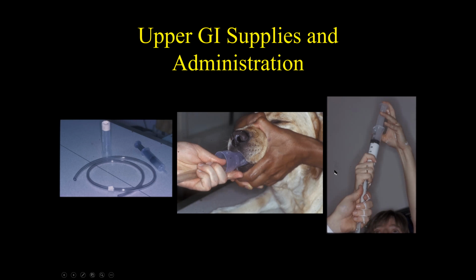So just ensure that, yes, the tip of the tube, I can see it in the stomach. Once you verify it's in the stomach, then you start loading your barium up. And so you would pre-fill, if this dog's 60 pounds, these hold like 60 cc's of barium. And so you're going to pre-fill maybe 10 of these syringes with barium.